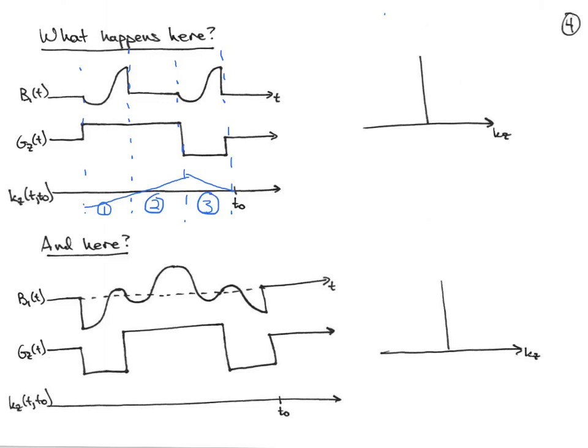Then we'll plot on the right here what happens for each of these time periods. Time period 1 starts out at negative kz and moves up to 0, so we know that it's going to go like that. The RF that's laid out during that time is half the pulse, like that. That's time segment 1.